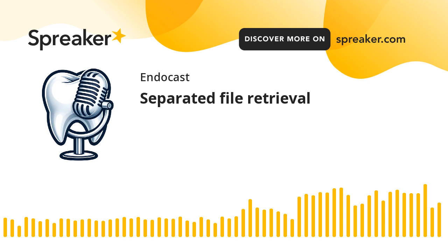We create space around the file and insert the lasso, or this wire. The wire will engage the loop. We tighten the wire around the file, then we can pull it out. For sure, it is not as simple as I'm describing. It needs lots of training. It needs getting familiar with this kind of tools and knowing exactly the techniques for applying them.